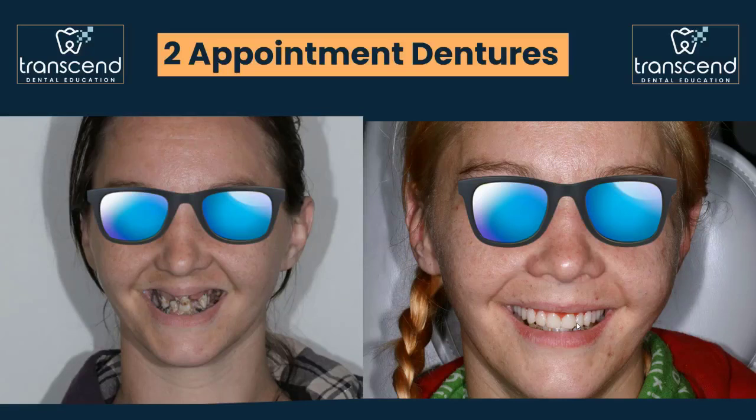And a denture like what is being shown right here is maybe $10 in overhead. Okay, and the only technology you have to accomplish this is a scanner, and that could be intraoral or desktop. I kind of like a desktop for dentures, but you can do it with either. So you need a scanner and a 3D printer. These are 3D printed dentures. The materials have finally caught up to where they're about comparable now to a conventional PMMA processed denture. Okay, that's it.